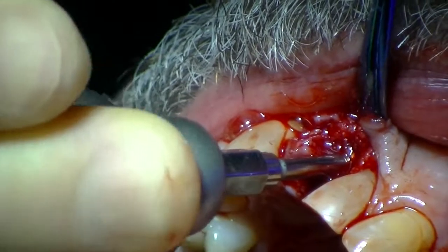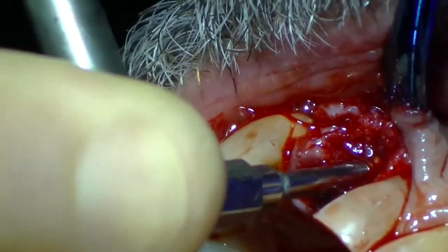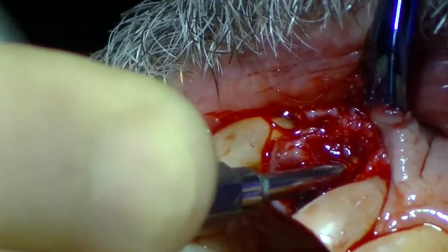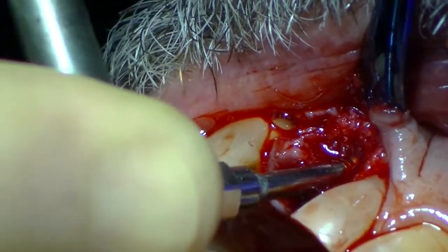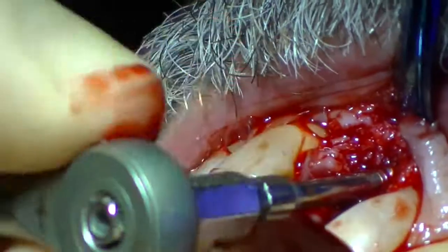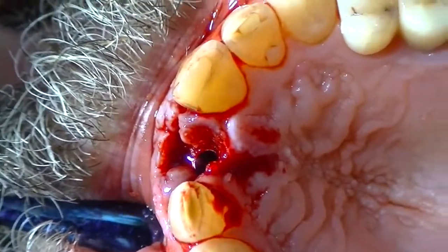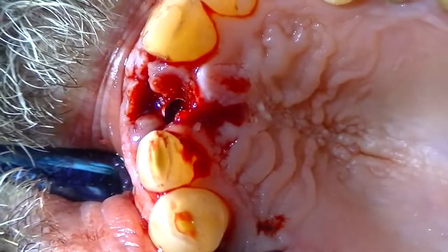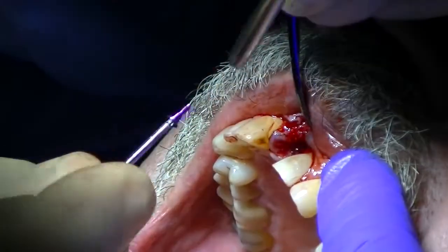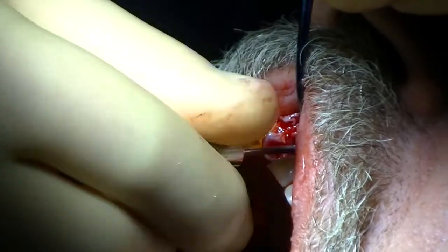Now this is an immediate extraction grafted site. To the position we want. Let's take a peek at it. I'm looking at there, that's a pretty good shot. You can kind of see the position of that implant, about 3 millimeters palatal to the facial aspect of the adjacent teeth. So I'm pretty happy with that positioning. I'm simply putting my cover screw, and we're going to bury this implant.